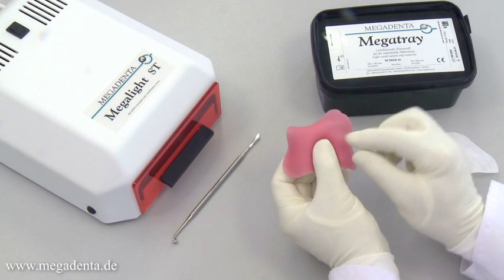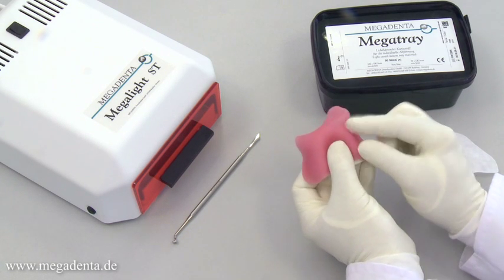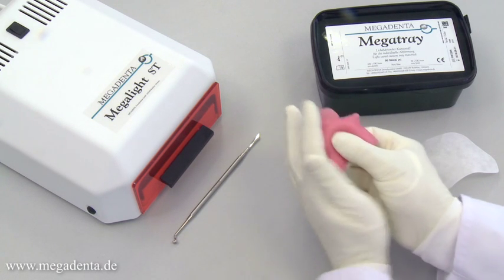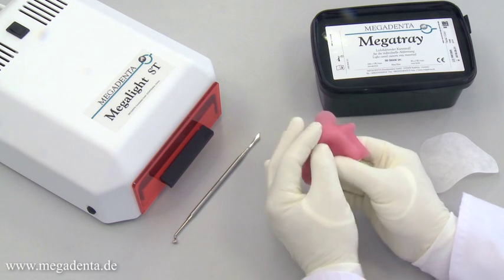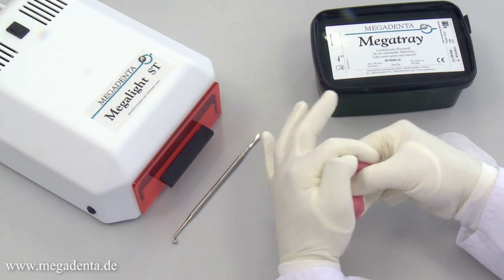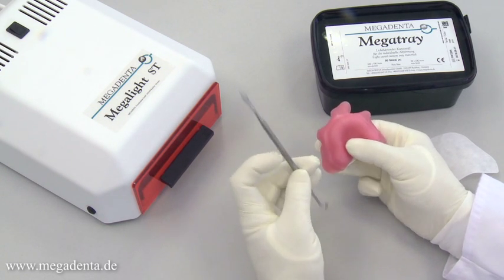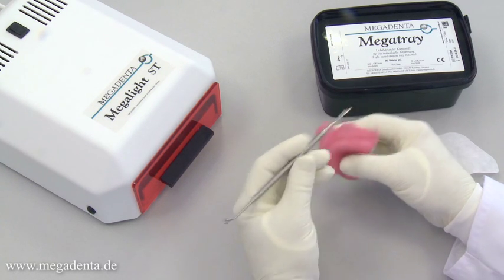The wafer can be adapted and customized with slight pressure on the model. The thin layer of Vaseline on the surface of the wafer prevents the light curing material from sticking during the process of modulating. Using the special shaped instrument Perf Master from Megadenta, it is easy to cut the oversized part of the wafer and customize the individual tray.